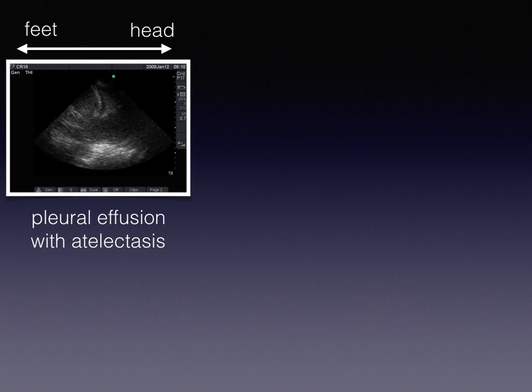So what do you look at when you get these proper views? Well, one, the orientation is different. It's in a cardiologic orientation where the feet are to the left and the head is to the right. This is due to the way we've gripped the probe as well as to the setup of the device.